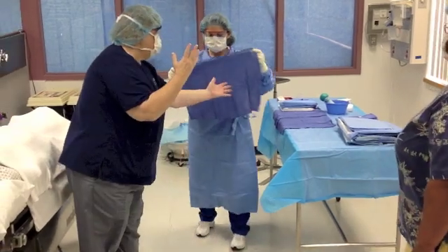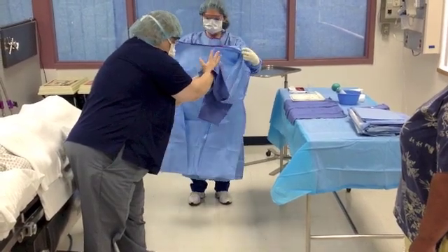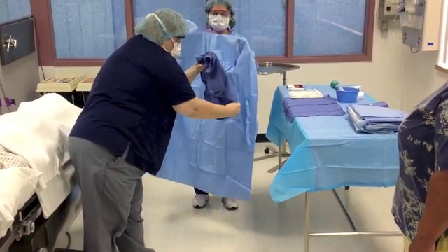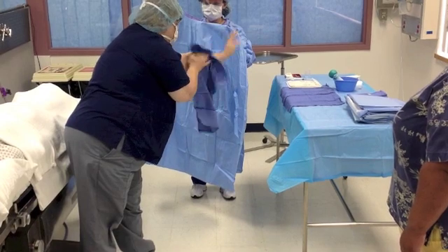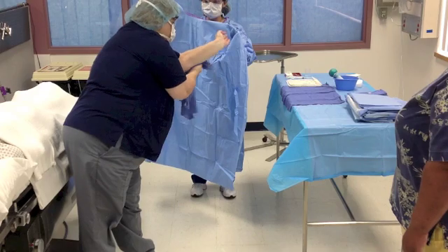Fully extend the hand towel. This time there is no need to worry about where to touch — you are sterile and the towel is sterile, therefore there is no risk for contamination. Lay one end of the towel over the hand that the surgeon extends toward you, being careful not to make contact with the surgeon's bare hand. Let go and let the long end of the towel fall between the surgeon's two hands. While the surgeon is drying their hands, obtain his or her gown from the back table. Grasp the gown and turn it so the inside of the gown faces the surgeon. Open the gown and let it unfold. The outside is now facing you — put your hands below the shoulder area and allow the top part of the gown to fold back over your hands. This forms a wide cuff that will cover your hands to prevent any cross-contamination.